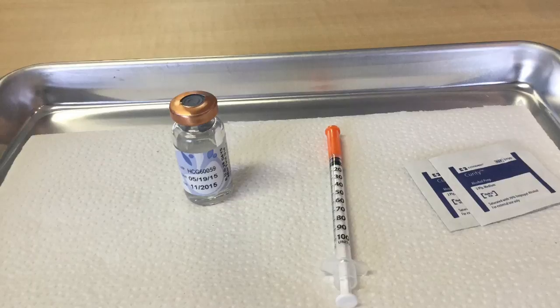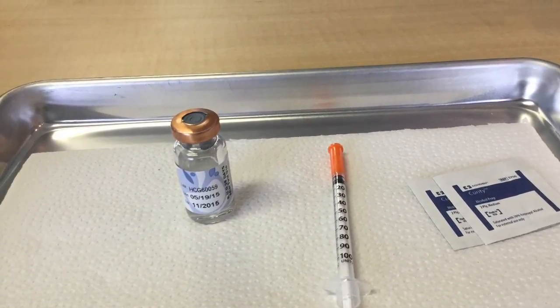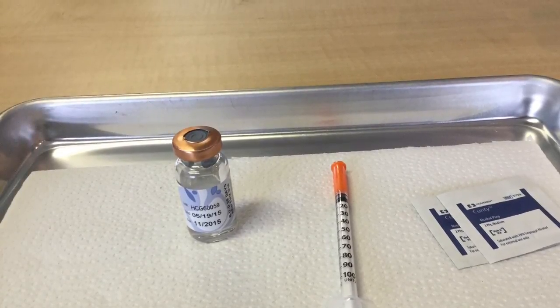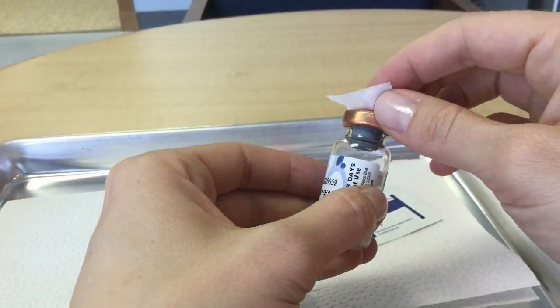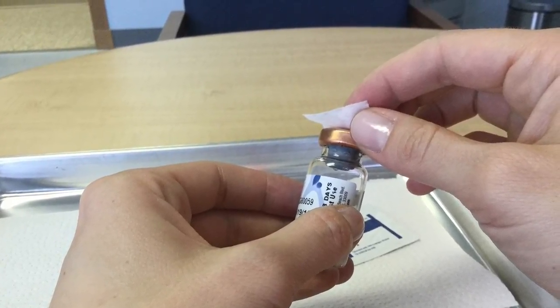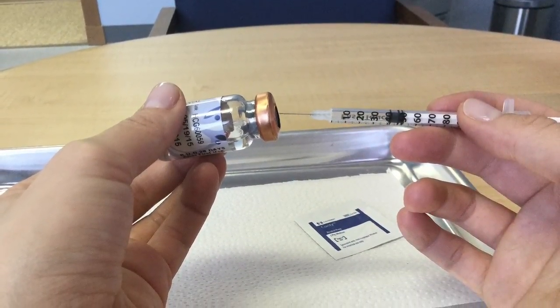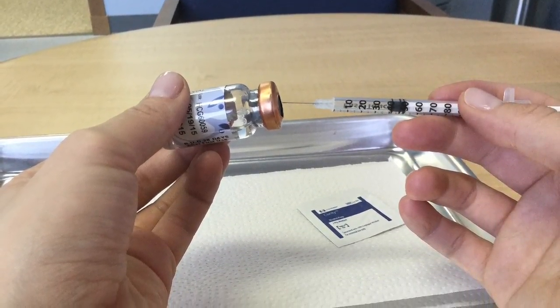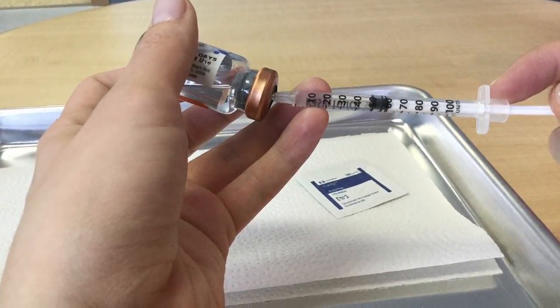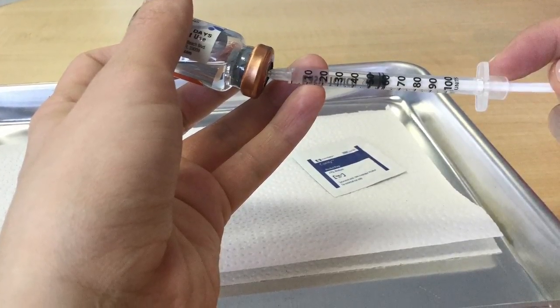Next, I will get ready to draw up the HCG for injection. I have the bottle of HCG, which I keep in the fridge unless I'm drawing up, and I have my insulin syringe. I'm going to go ahead and wipe the top of the HCG vial with the alcohol pad, inject a little bit of air from the insulin syringe into the HCG vial, and draw up whatever amount my doctor has prescribed. Common amounts would be 50 units — that's the same as half a ml — or 75 units.